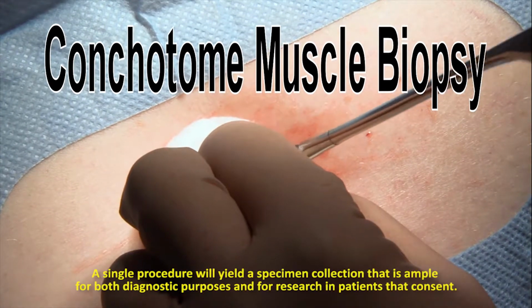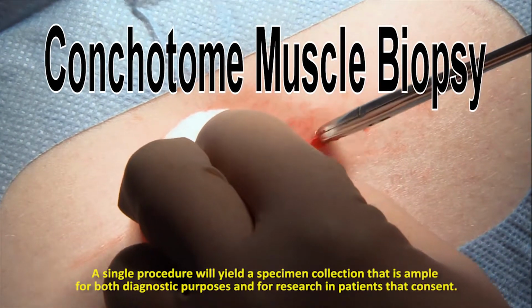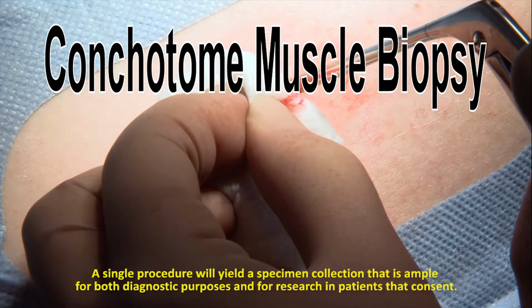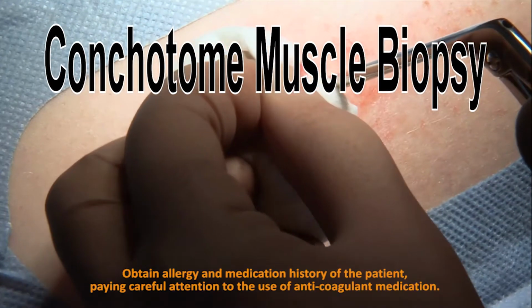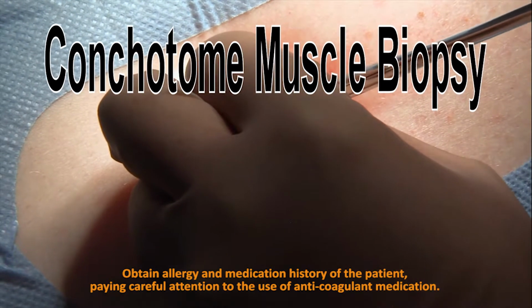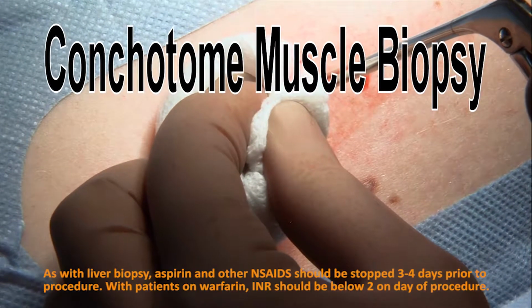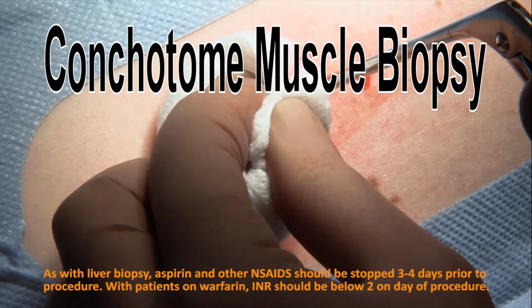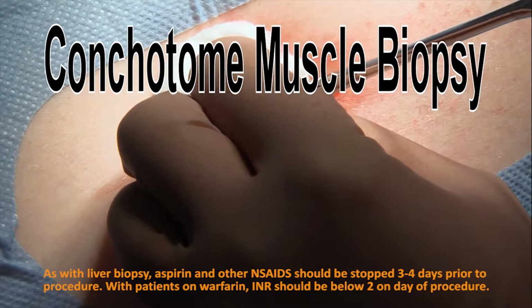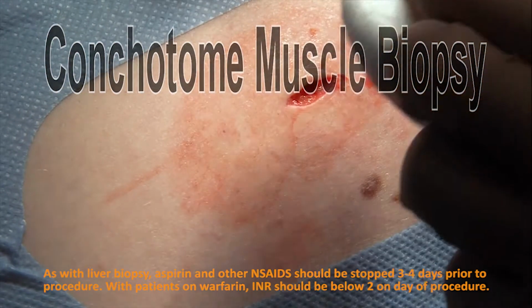A single procedure will yield a specimen collection that is ample for both diagnostic purposes and for research in patients that consent. Obtain allergy and medication history of the patient, paying careful attention to the use of anticoagulant medication. As with liver biopsy, aspirin and other NSAIDs should be stopped 3 to 4 days prior to the procedure, and with patients on warfarin, an INR should be below 2 on the day of procedure.